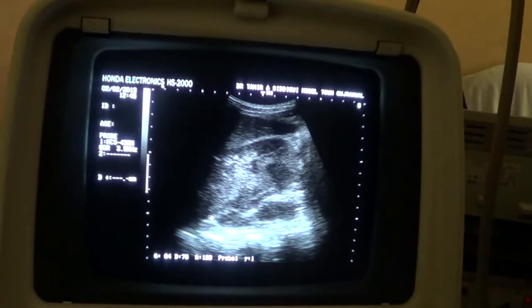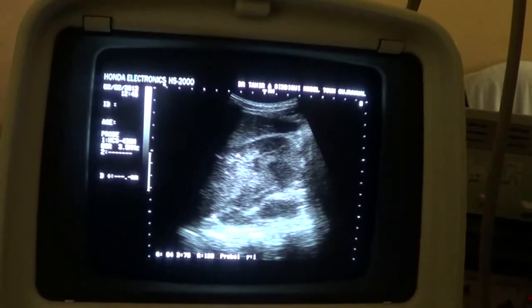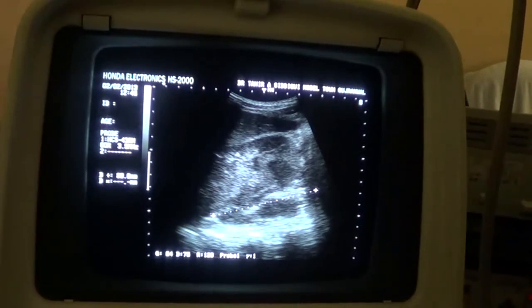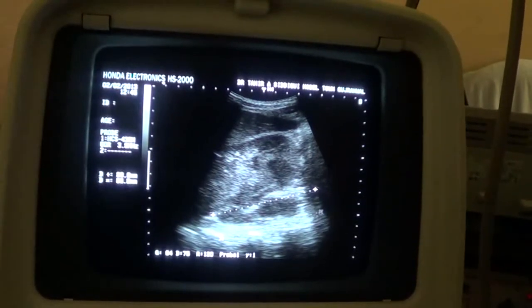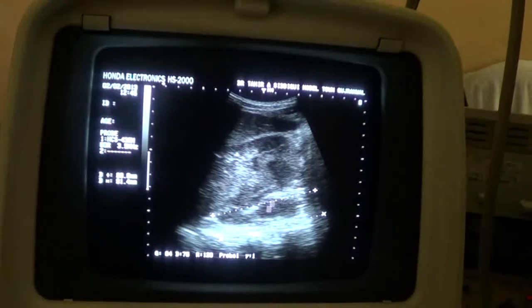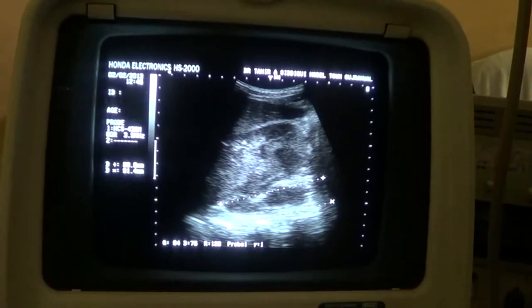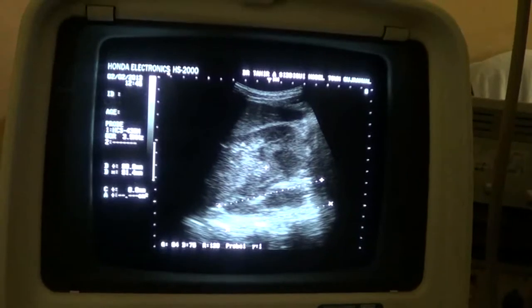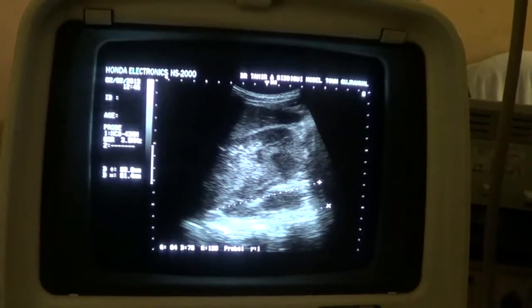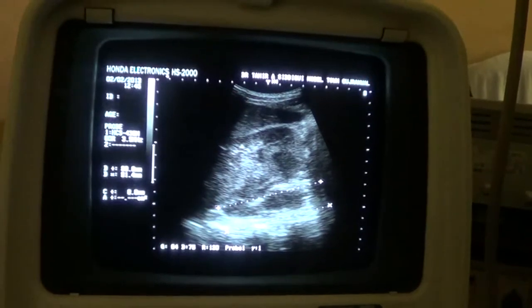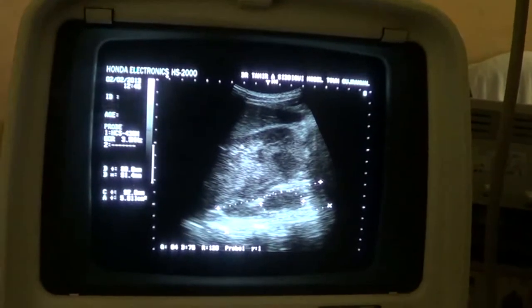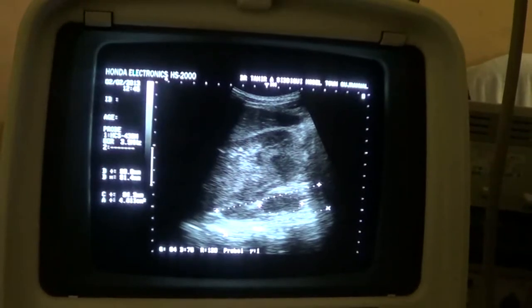Now this is the psoas muscle on which the kidney glides. This is the right psoas muscle, and we see again that there is a cystic, echogenic cystic area within the psoas muscle as well. This is that area.